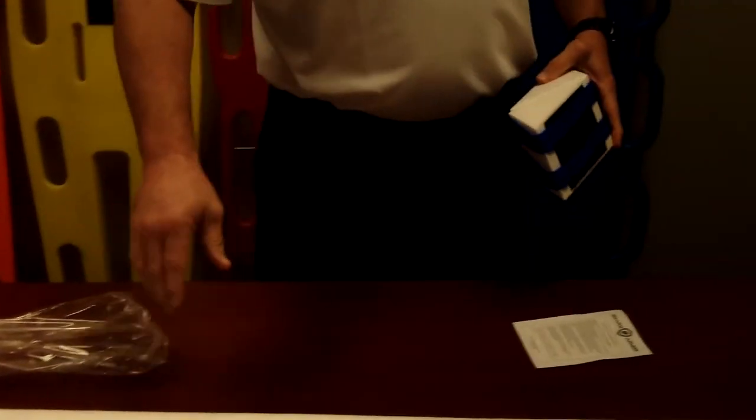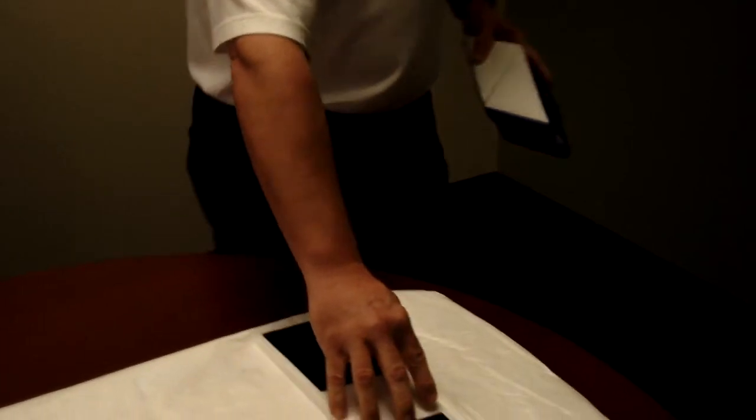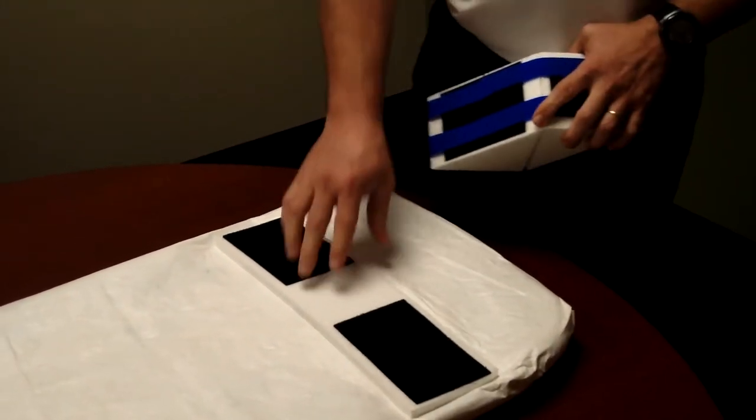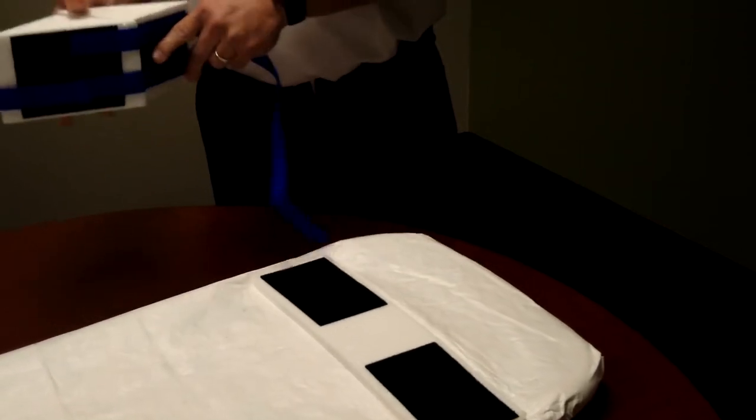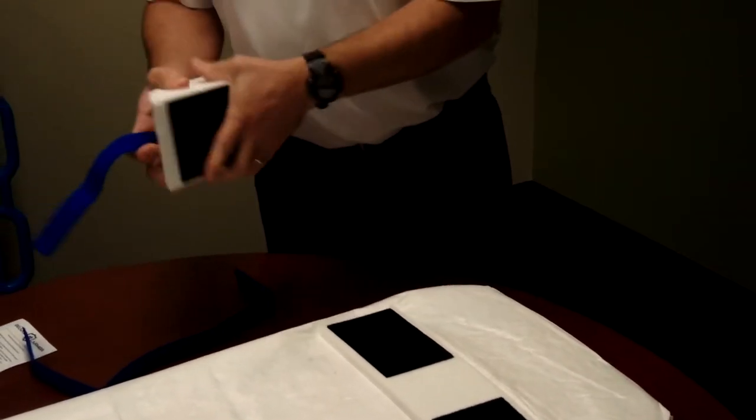At this point in time your cover is ready to be used. The patient's placed in position, patient's head goes on the non-velcro portion of the head base, and you have individual head blocks with your head and pin straps already attached.